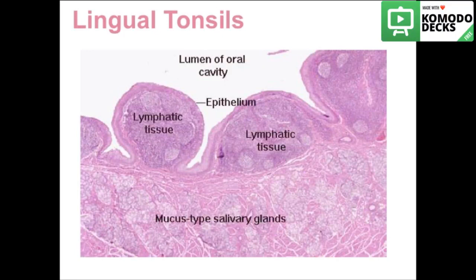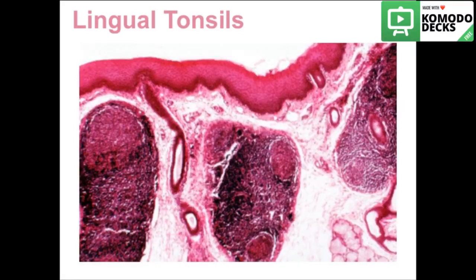The specialized epithelium of the lingual tonsils makes masses, with deep crypts within the epithelium that contain lymphatic tissue or lymphoid tissue. The mucus glands could also be present in the submucosa, and lymphoid tissue within the epithelium.